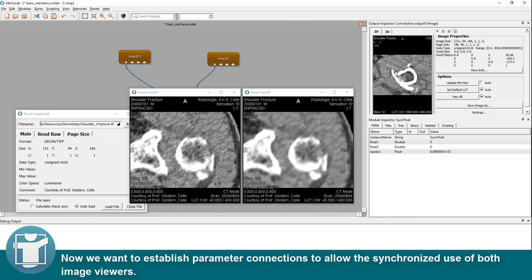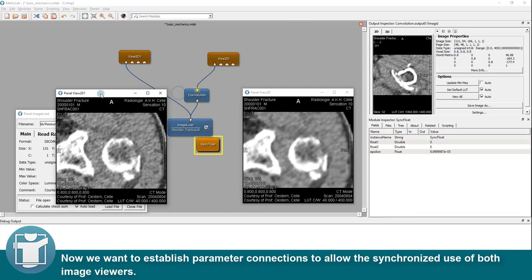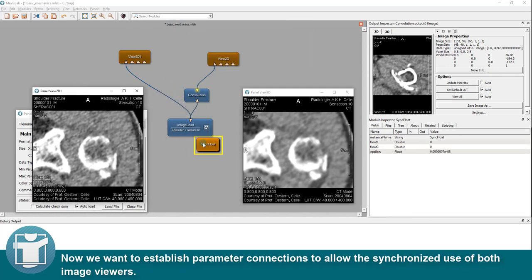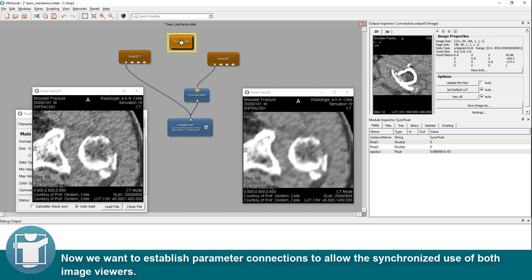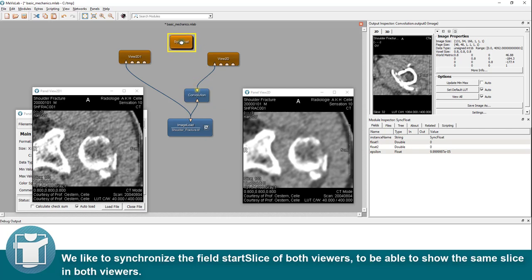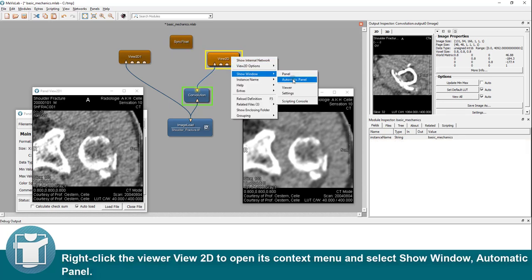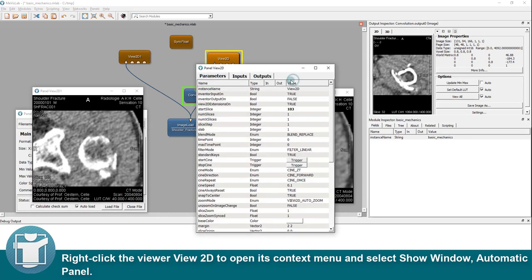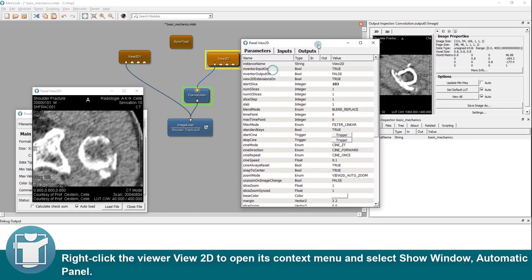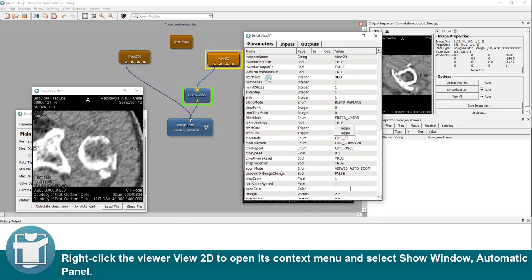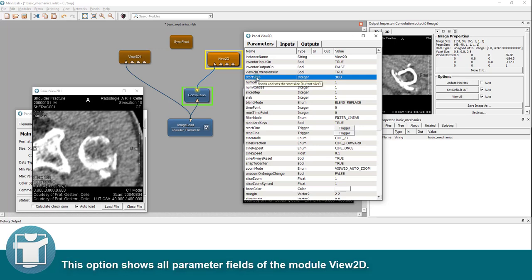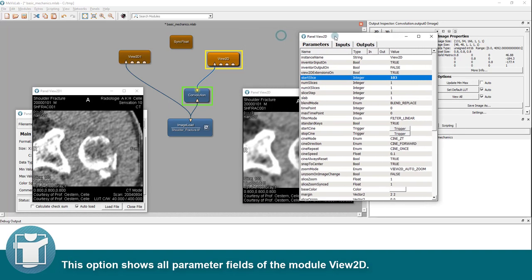Now we want to establish parameter connections to allow the synchronized use of both image viewers. We like to synchronize the field start slice of both viewers. To be able to show the same slice in both viewers, right-click the viewer view 2D to open its context menu and select Show Window, Automatic Panel.